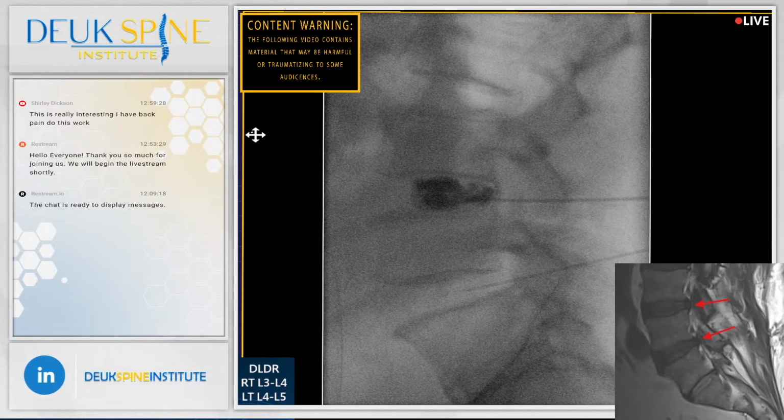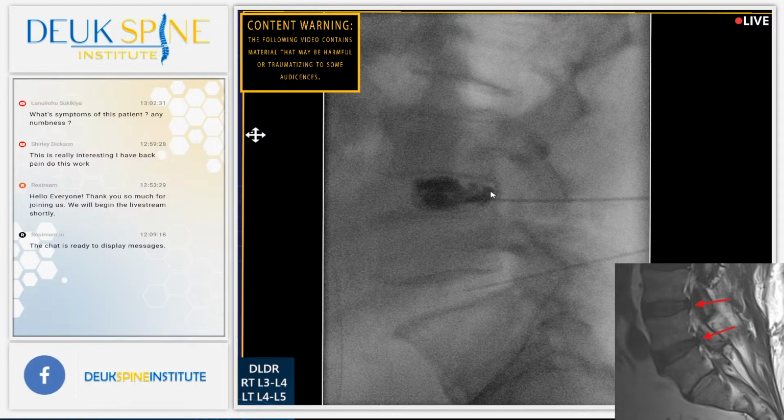So we tested the top one. You guys see that, Jordan? Show the audience on the lateral x-ray the tear. Okay, you see the black dye? The black dye is what I injected. It should stay in the middle. You see the cotton ball in the middle? That's where it should stay. Show us where it should stay, the big circle. Yep. It should not be leaking backwards right there. All that is dye leaking through the tear along the herniation. That's where his pain's coming from. Is it better now?